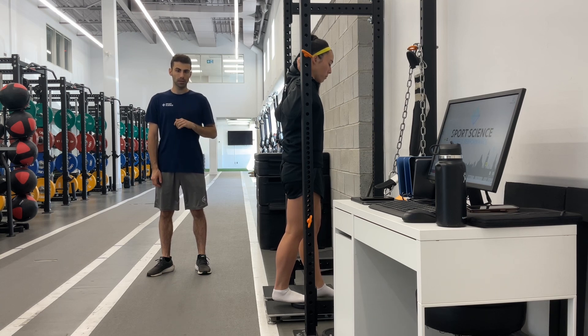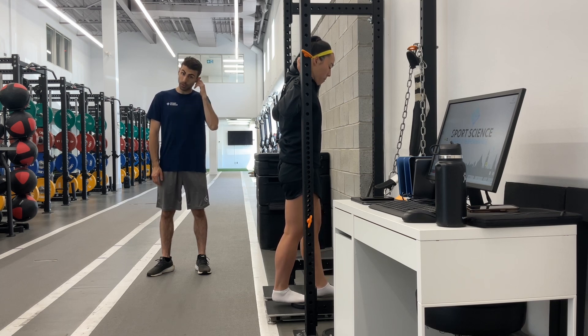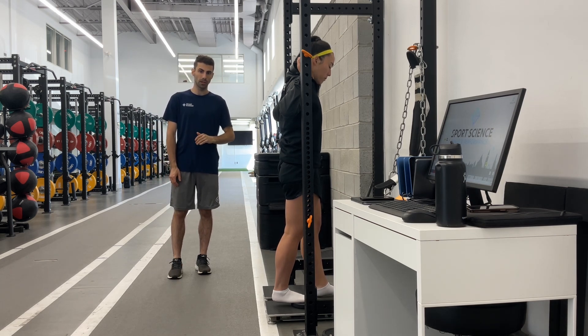With the setup position for this test, we're looking for a slight lean forward of the body. We want to have the hip and knee in alignment with the knee straight. The ankle position we're going to have is between 10 degrees of plantar flexion and neutral.